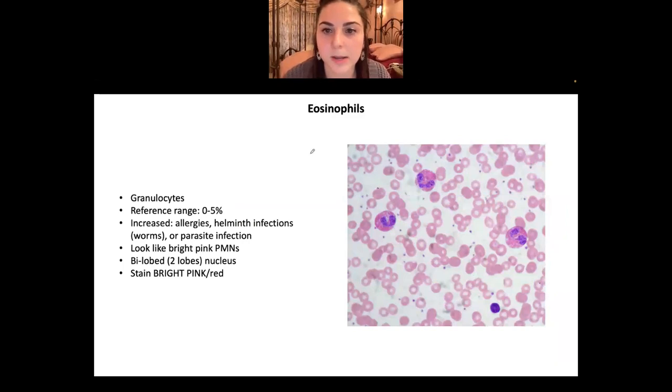Okay, good. Eosinophils, really easy to identify. I think this is the one that they asked about on the exam for my year at least. I think they change it, but they're easy to identify because they're just giant pink granules in the cytoplasm. So these are granulocytes, right? Remember, eosinophils are a mediator releasing cell. Here's the pink, they literally stain pink. They stain like this. And then here's a lymphocyte down here. So you can see this is a giant nucleus taking up pretty much the entire cell. So they kind of look like neutrophils, but they have pink granules.